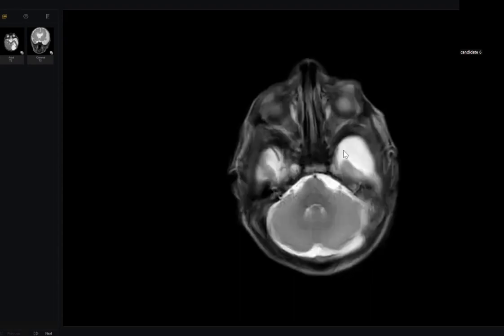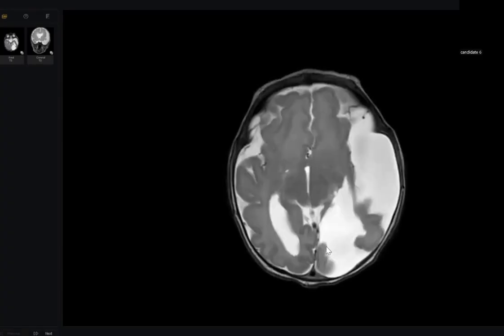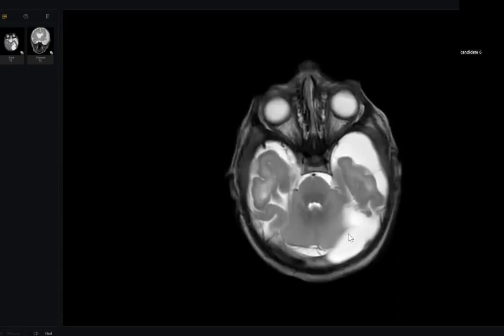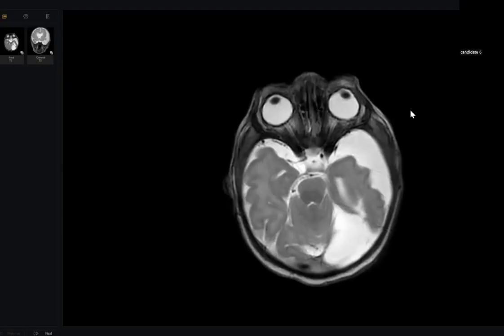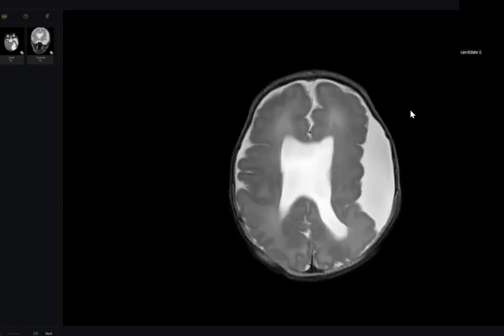Thank you, doctor. Take care, my colleagues, of the absence of septum pellucidum. Very important. It must increase the suspicion of septo-optic dysplasia. It is one of the midline cleavage anomalies, which means septo-optic dysplasia can be a part of or related to holoprosencephaly, because all of them have absence of the septum pellucidum.